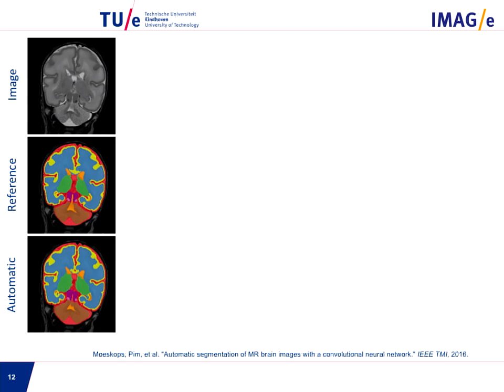So we have the image at the top, the reference segmentation in the middle, and then the automatic segmentation at the bottom. It might be a bit small, but you can see that it seems to perform quite well.